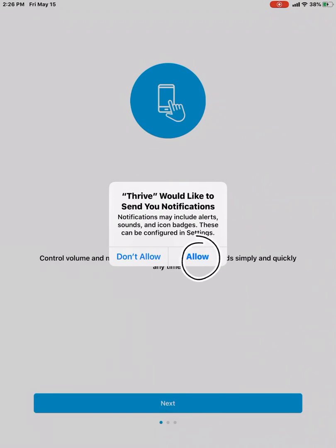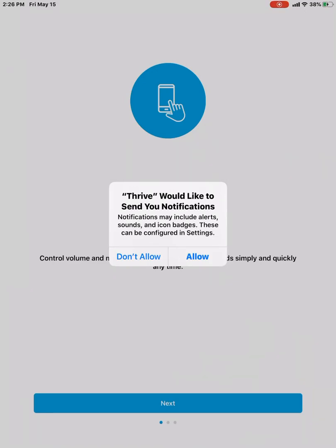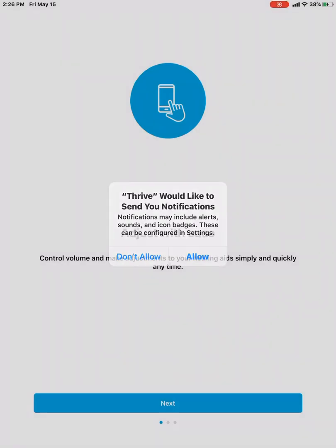And then it just asks if we want to allow notifications. And we do because the Thrive app will give us notifications if you're wanting remote programming adjustments or things like that. How you'll receive those notifications will be through the Thrive app. Or how you'll contact your hearing healthcare professional will be through our Thrive app. So we'll allow the notifications.